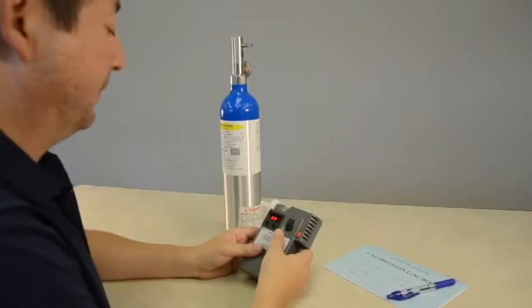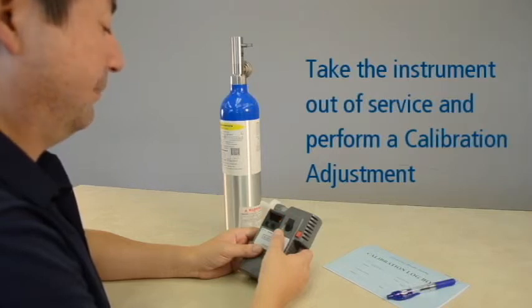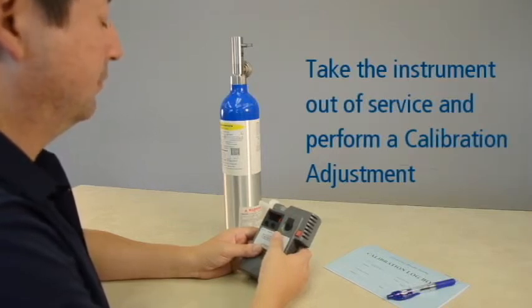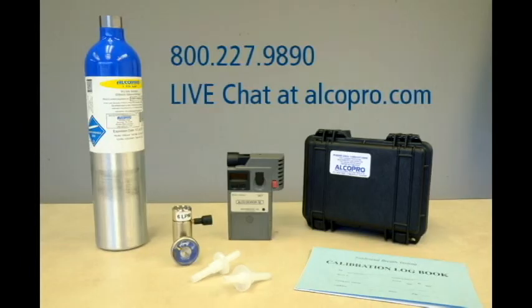If the result of your accuracy check falls outside of the acceptable tolerance range, you must take the instrument out of service and perform a calibration adjustment to bring the instrument back into an acceptable tolerance range. You can view the Alkosensor 4 calibration adjustment video for step-by-step instructions. If you need technical support or repairs on your Alkosensor breath alcohol instrument, contact one of our factory trained technicians at 1-800-227-9890 or through live chat at alkopro.com.